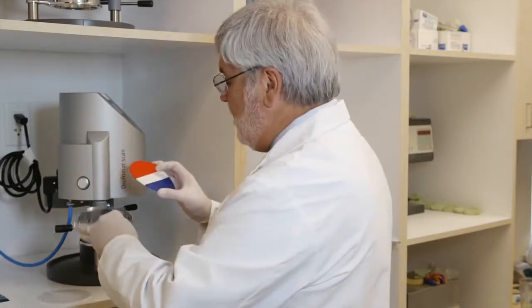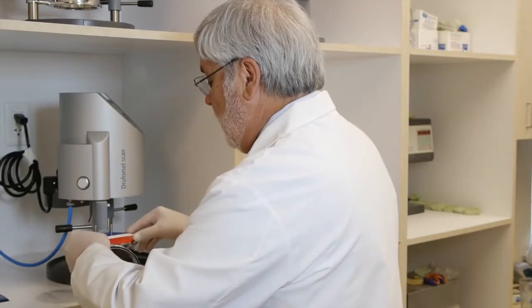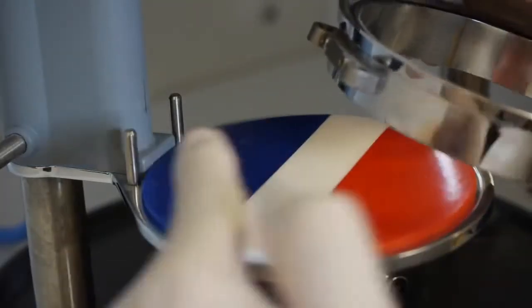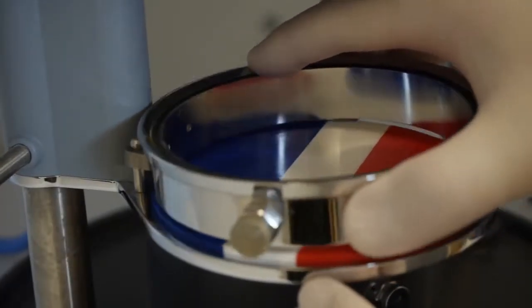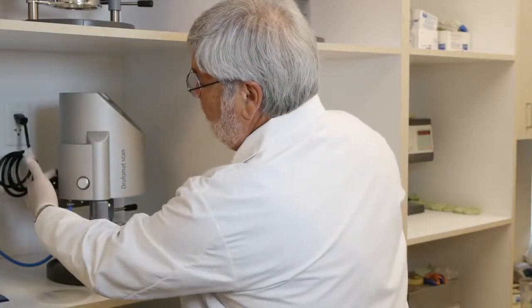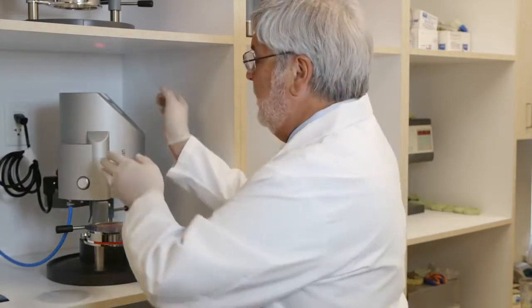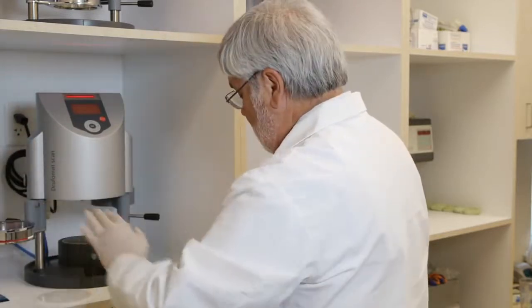First thing we do is we place the mouthguard material in the ring. These 2 holes you see right here must fit in these 2 posts. Okay, now we have to turn the machine on, so we'll turn the machine on from the back. You'll hear a little beep. That means the machine is on. Material is in the machine.